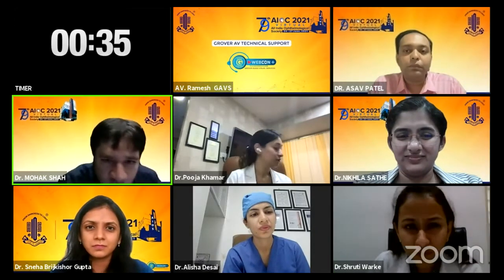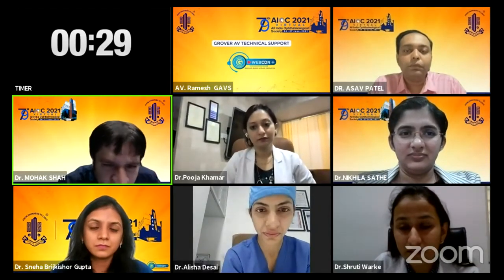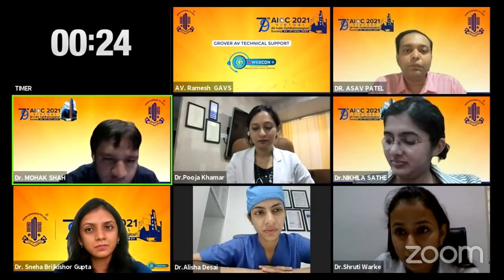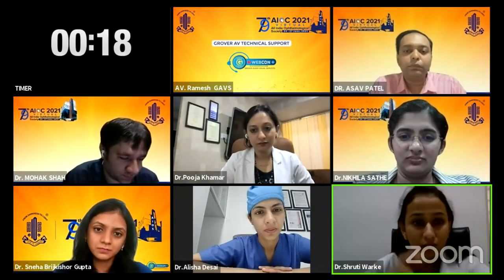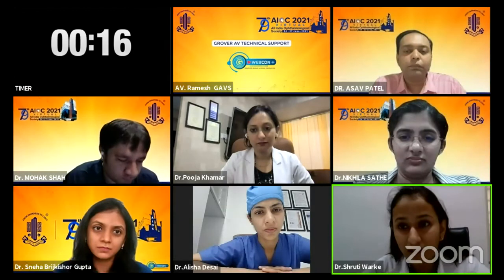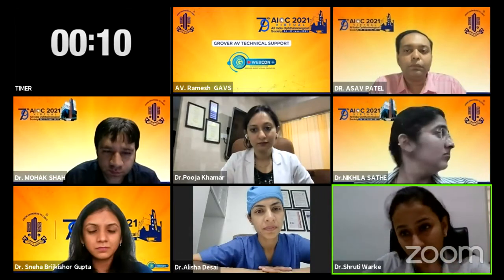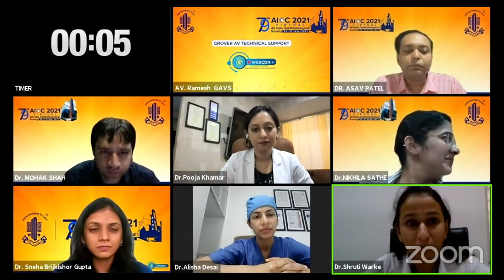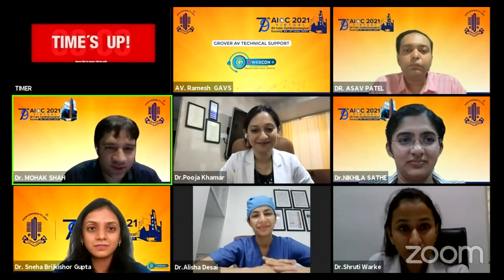What Dr. Sneha showed was a scar management using the topo-guided PTK. It is basically a PTK, but a customized decentered PTK. So do you have any experience on your Bausch and Lomb machine? Is there any software like that, or have you done it any other way? No, the Bausch and Lomb machine doesn't have that software to customize the PTK. You have to use the zone, and probably you can decenter a little bit on the area, focus on that area and fire. But it doesn't have the customized software inbuilt. Probably they should build it in now. Okay, I think that's a take-home message: every other excimer laser platform should have this software. I'll let you know regarding the Zeiss one.